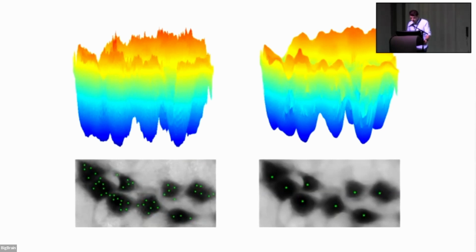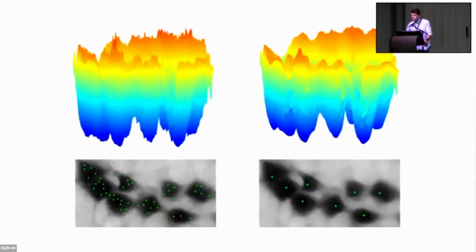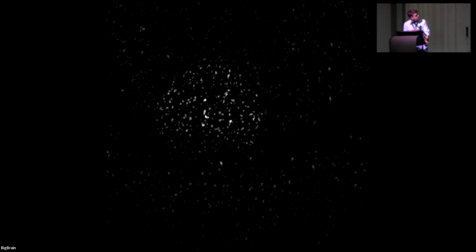After precise localization, it's easy to just use a watershed, which this smoothing also facilitates. Let me just stand up a little bit. So you get these things even more easily. And this is one example of output. I'm not sure if you see it well. Here, larger neurons are shown brighter, right? You see that this is layer 3 with big pyramidal neurons, and maybe this is layer 4 with many smaller, densely packed neurons.